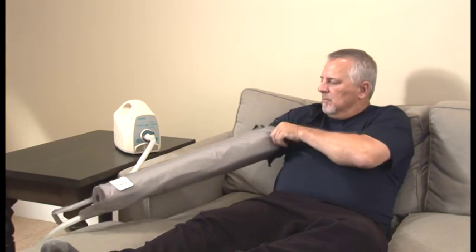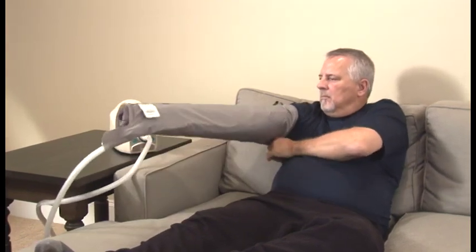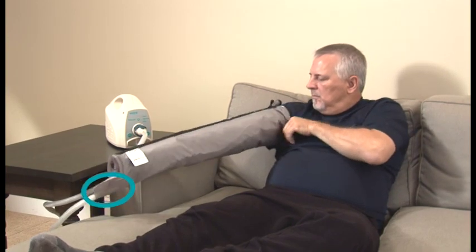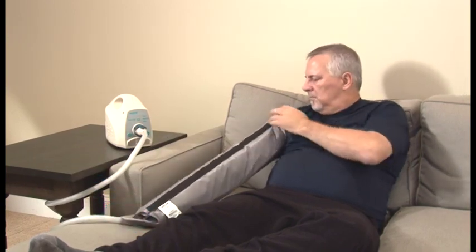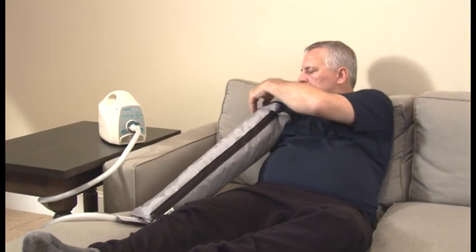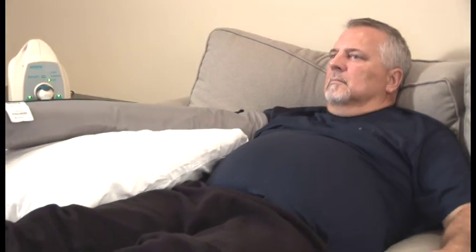Similarly, if you are using the arm garment, slide your affected arm into the open end of the garment, which is the side opposite from where the air hose exits. Position your arm so the garment is pulled over your shoulder and your fingertips remain fully enclosed in the garment. The zipper should align with the top of your shoulder.